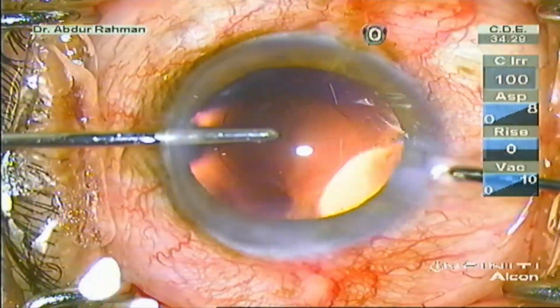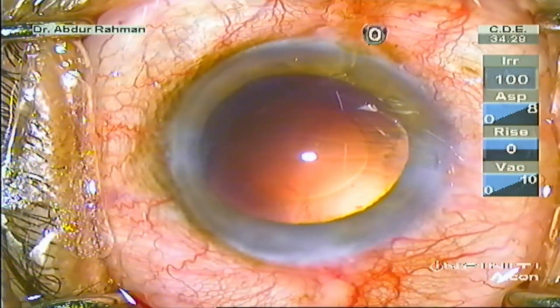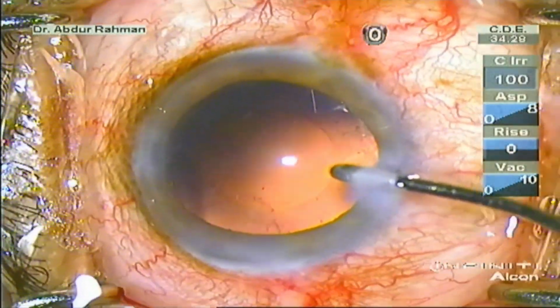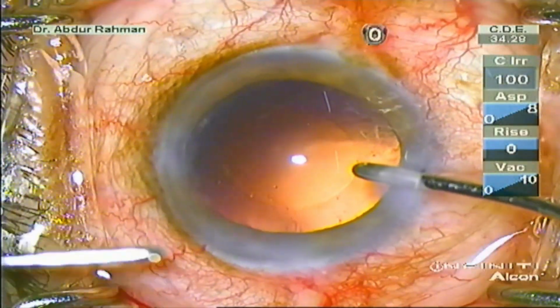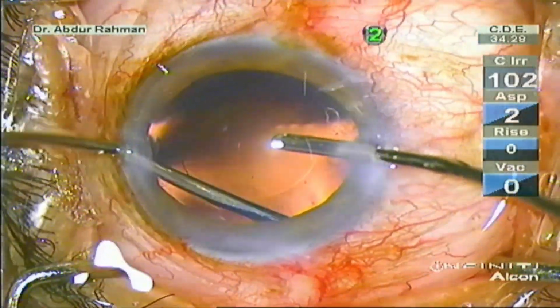Now enlarge the main port with a 2.4 mm keratome. The incision is enlarged to 2.8. The AC was formed with the irrigation handpiece. I saw a little bit of cortex, so I'm cleaning it with the bimanual IA handpiece.